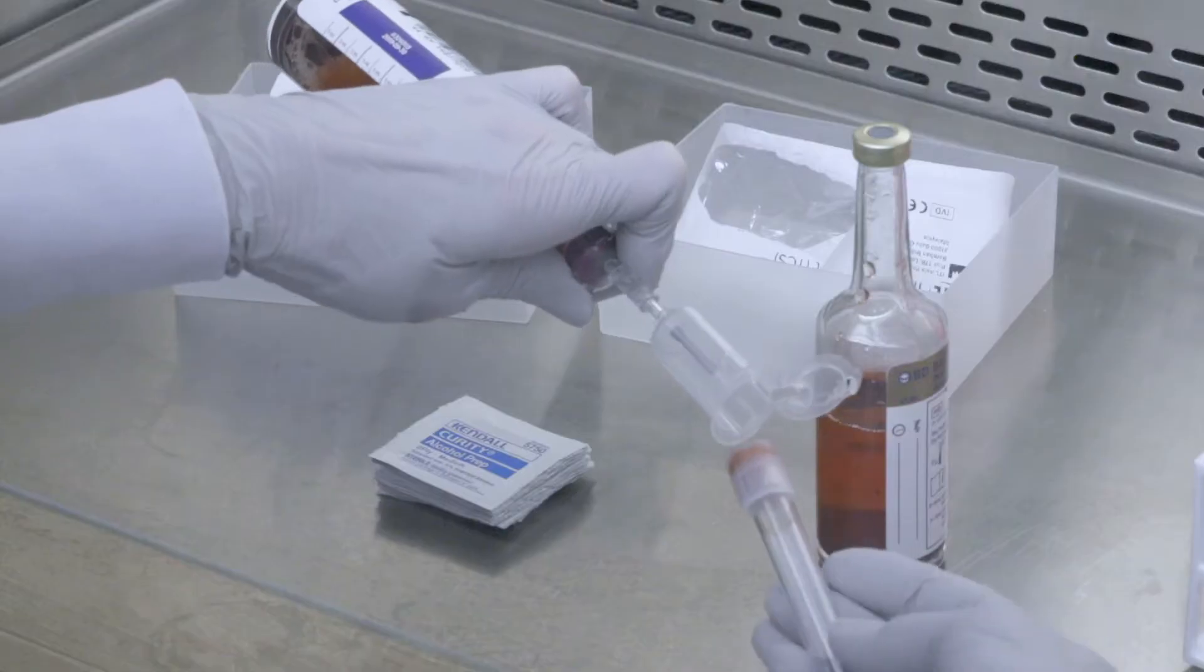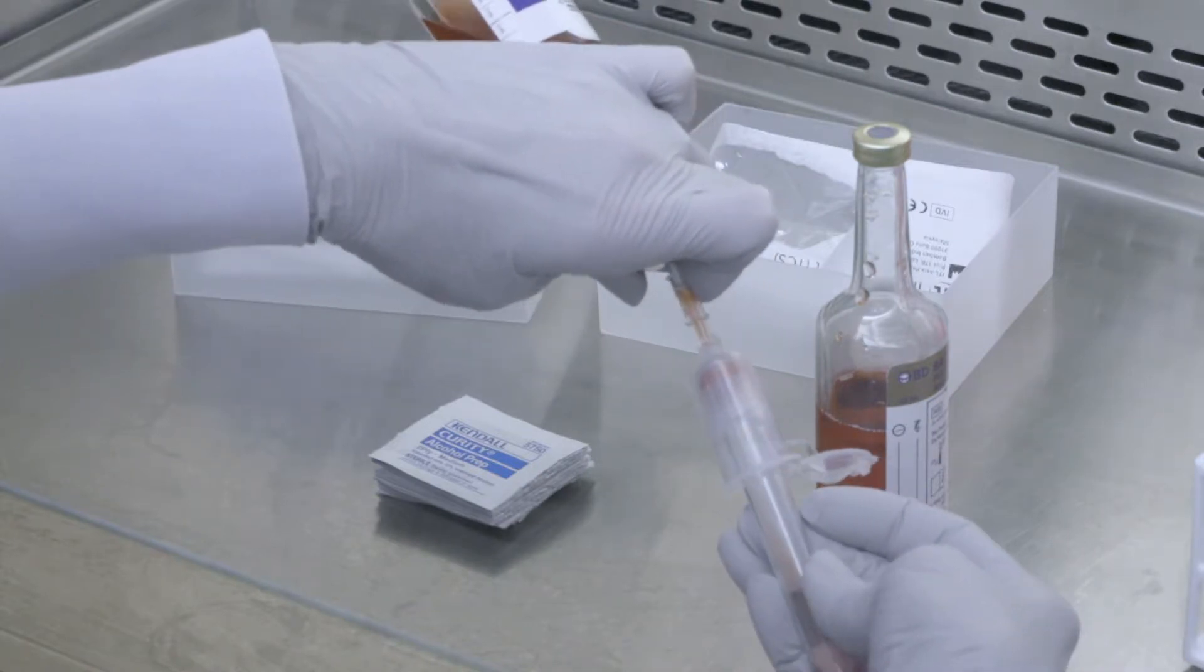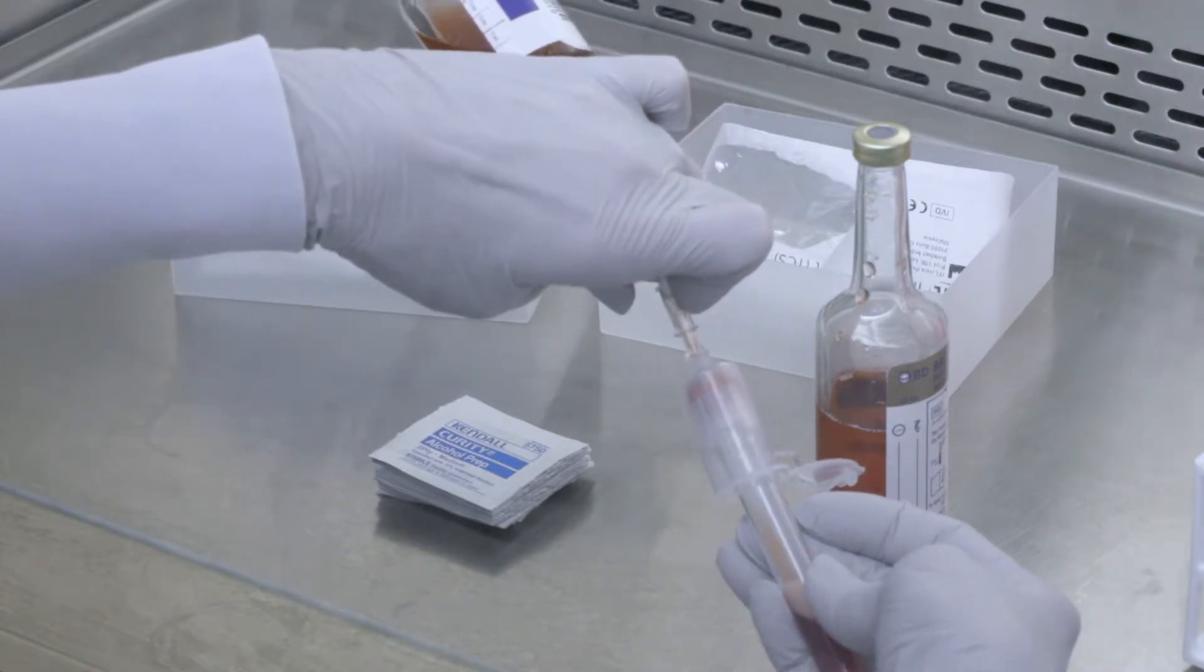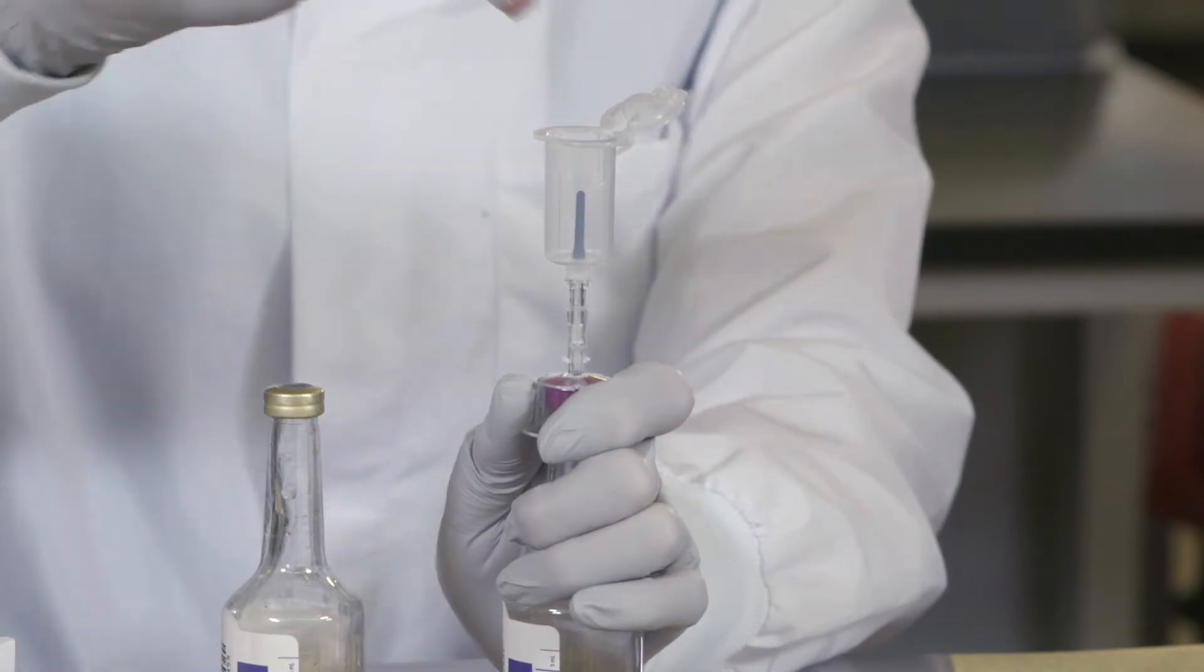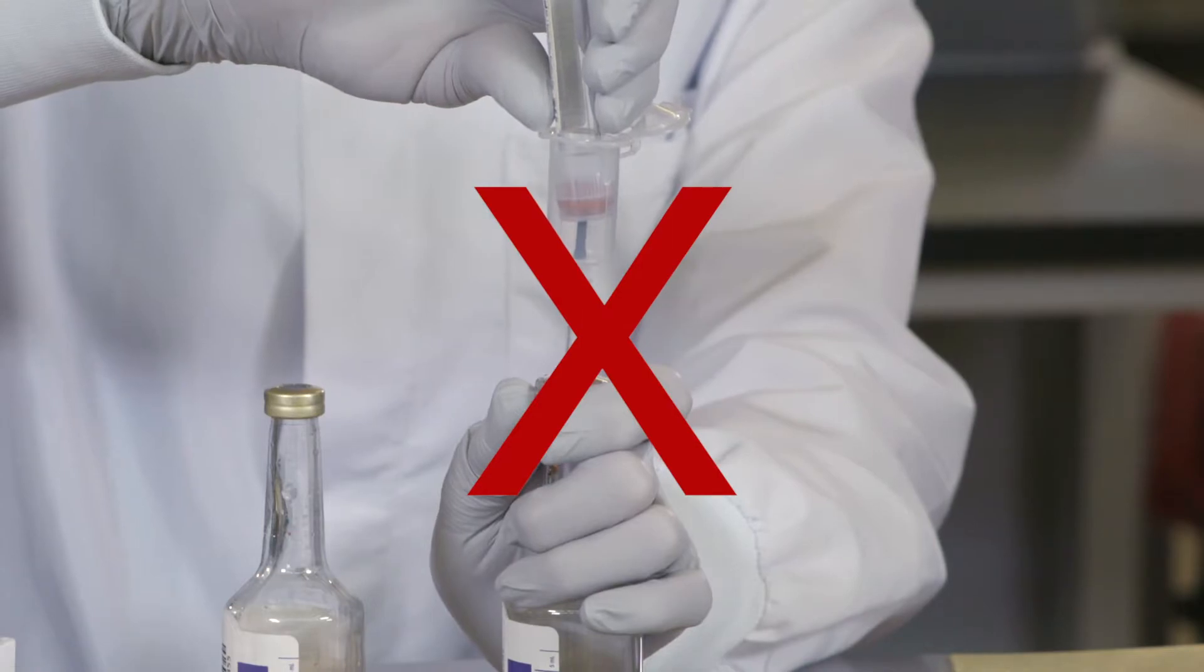Now, insert the vacuum tube into the tube holder. Sample from the culture bottle will begin to transfer into the vacuum tube. Note that sample will only transfer into the vacuum tube when the culture bottle is tilted at a downward angle.